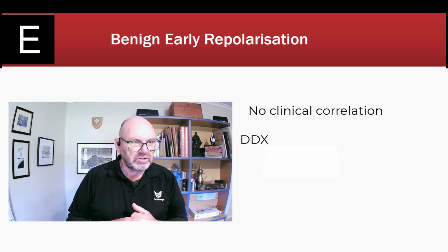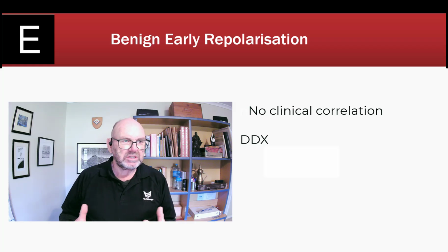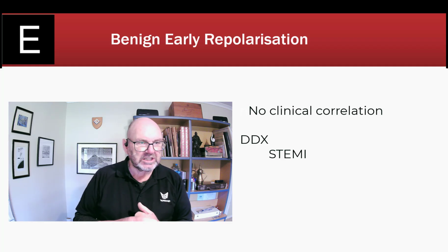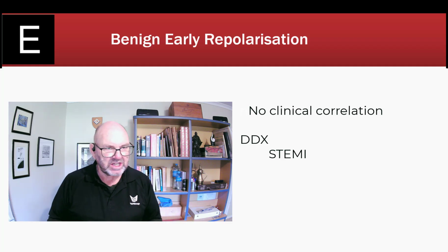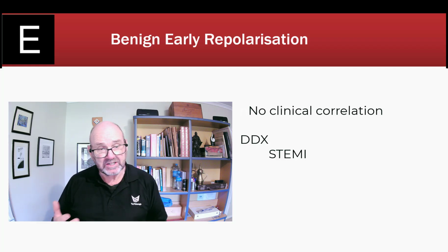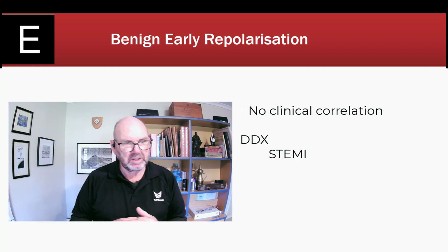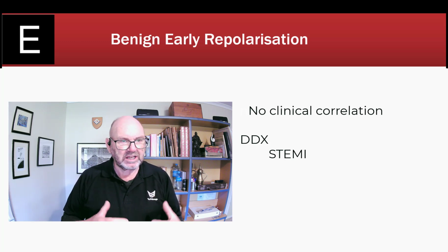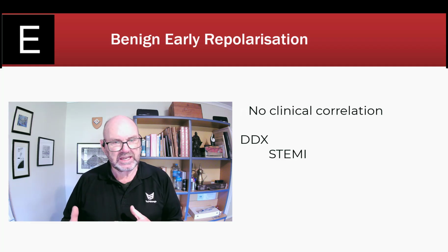In terms of differential diagnosis, however, it's important to make sure that it's not a STEMI. So the main factors for consideration are the regionalisation and reciprocal changes to any ST segment elevation, which would favour STEMI, or whether there's correlation with clinical examination signs that suggest ACS.